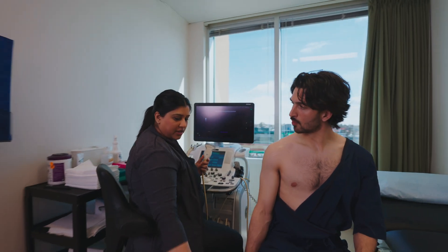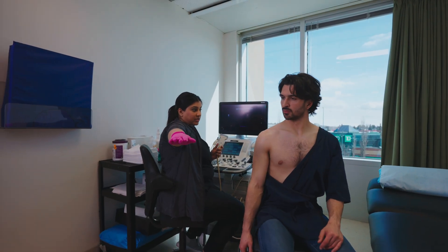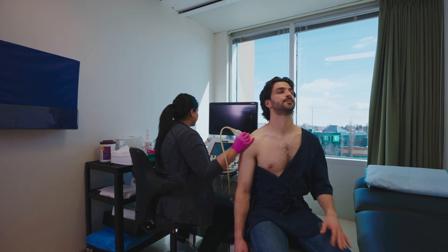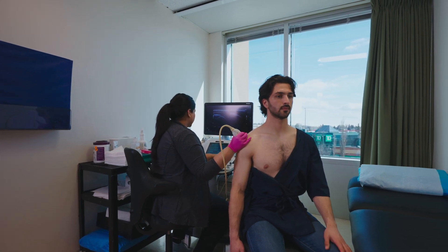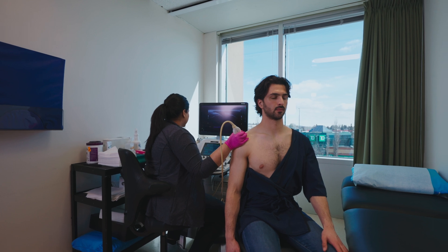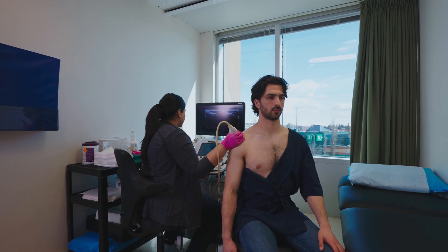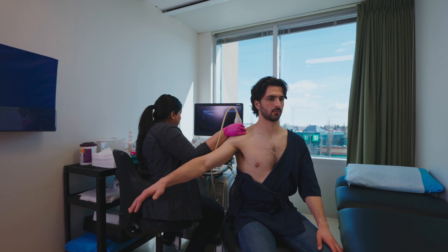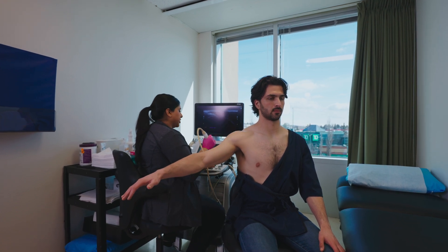When I'm all set up and ready, I'm just going to get you to do your best to raise your arm out to the side. When I'm ready, I'll let you know when to do that. All right, go ahead. That's perfect. You can stop there. Good. And just bring your arm back down.